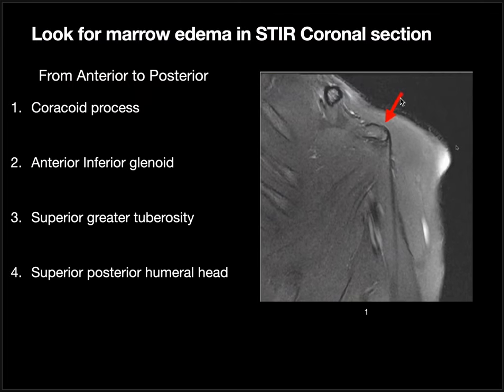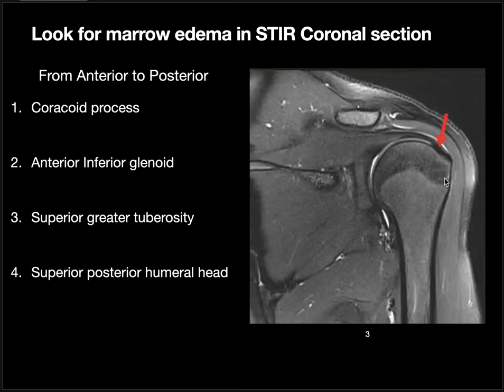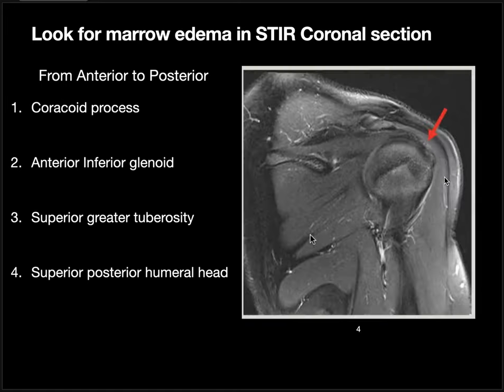Next, when looking for bones, we should also look for marrow edema. For that, we use coronal sections, and going from anterior to posterior, there are four potential sites for marrow edema: first, the coracoid process; second, the anterior inferior glenoid process; third, the superior greater tuberosity; and fourth, the superior posterior humeral head.